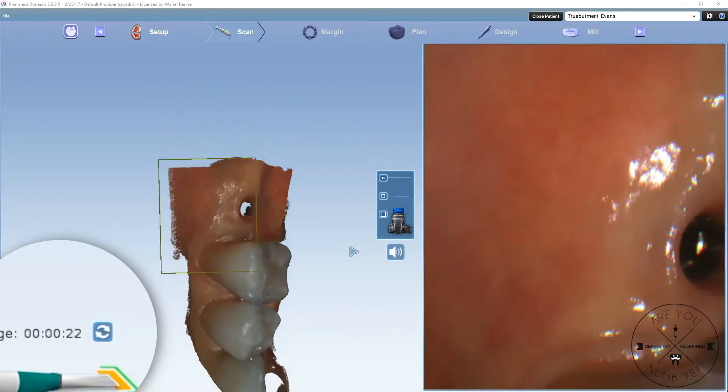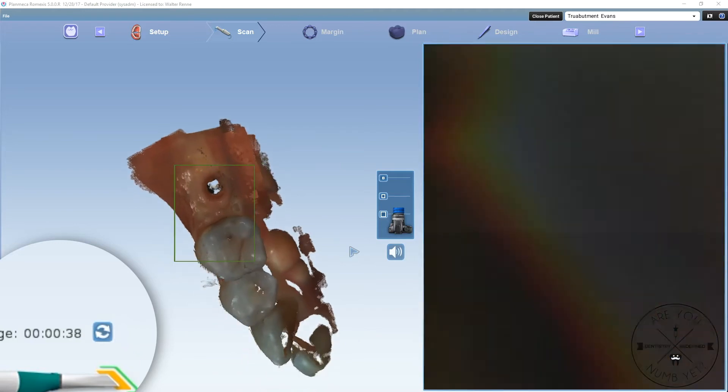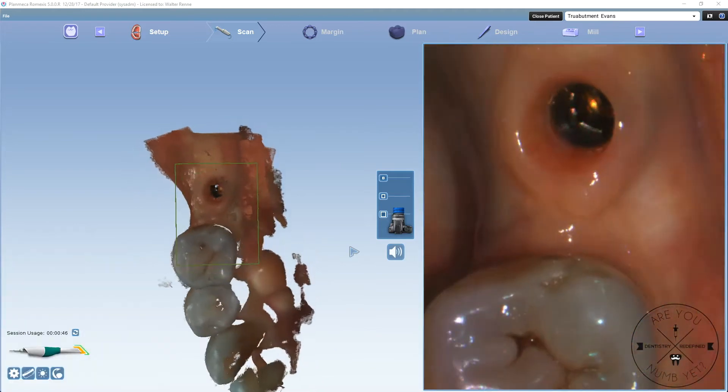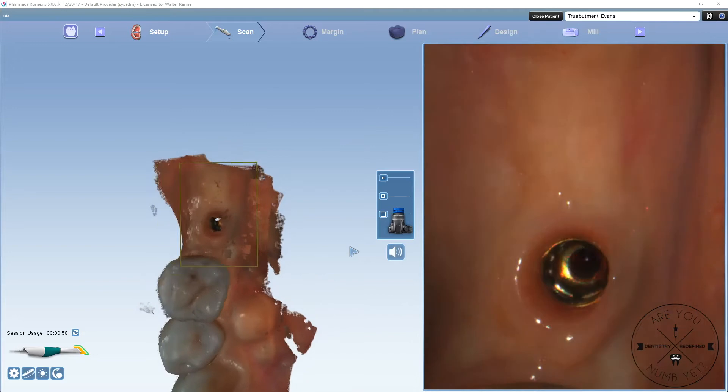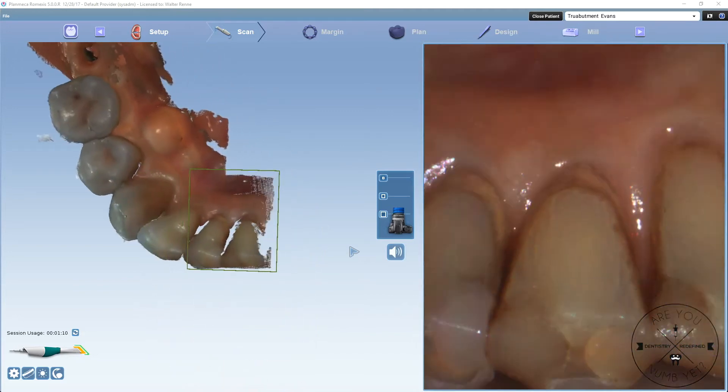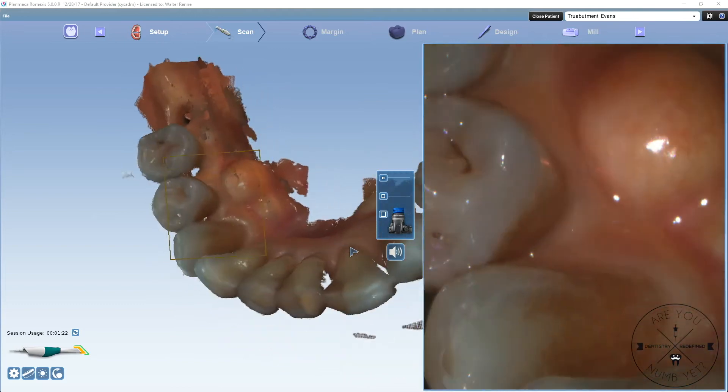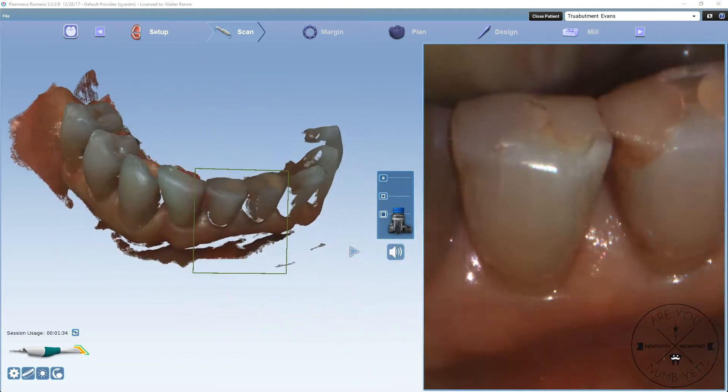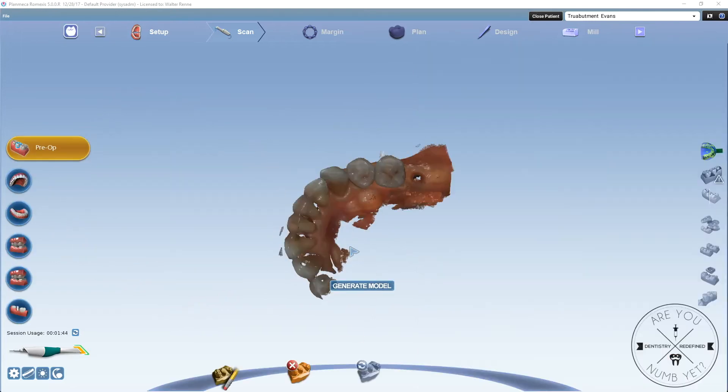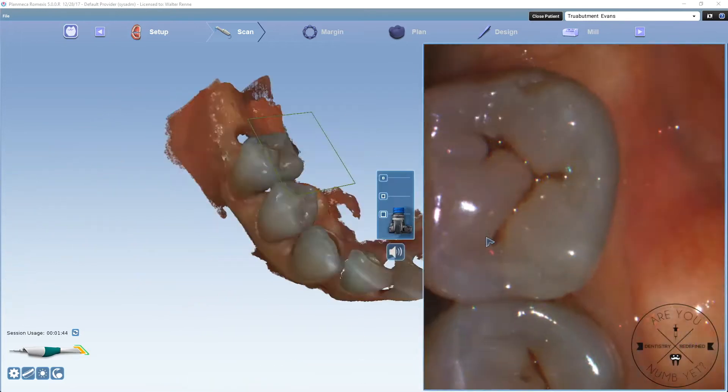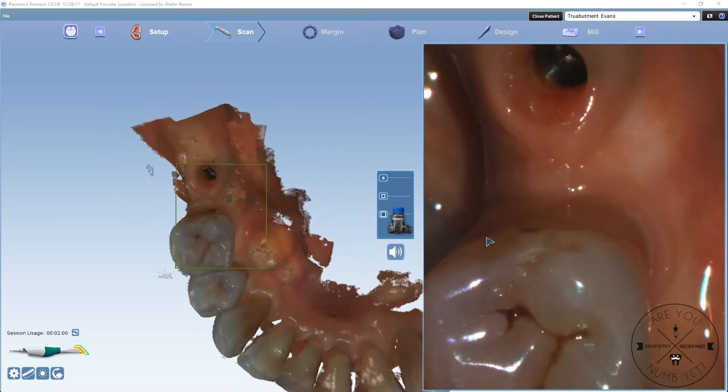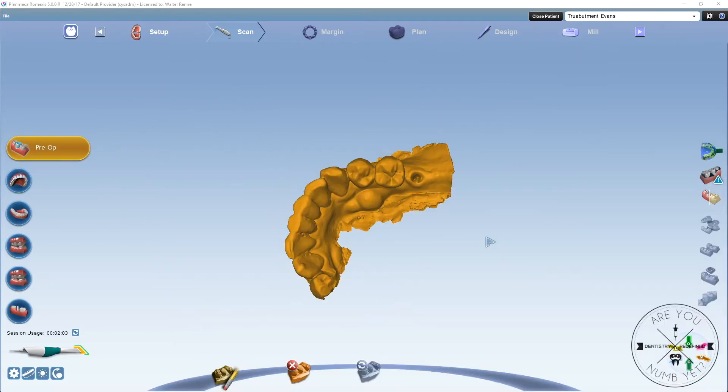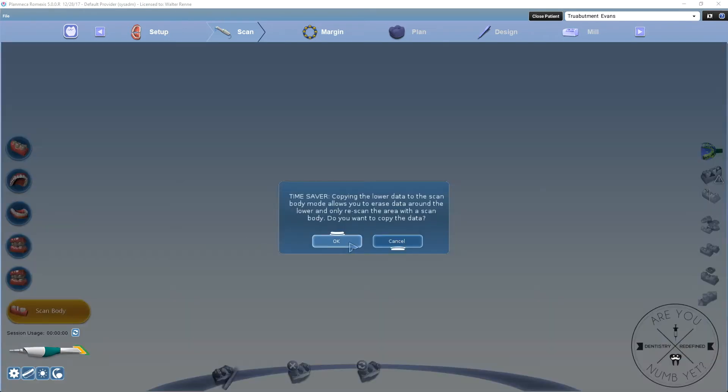The first step is to basically scan the edentulous area and the adjacent teeth. You could use the Plantscan, you could use the Emerald. Any scanner that you have is going to work for this. The most important thing for this initial scan is to capture enough teeth, enough data to get a good occlusal reference. I like to go cross-arch canine at least, even for this little single unit. You also have to capture those interproximal surfaces to get a good final restoration.